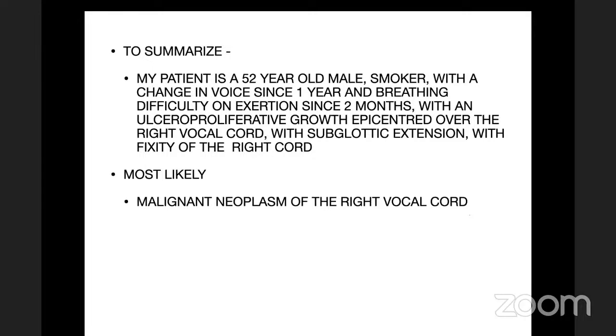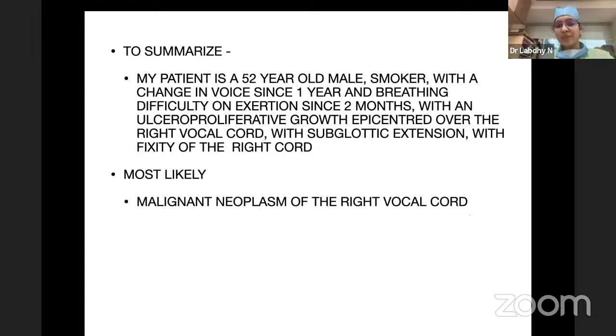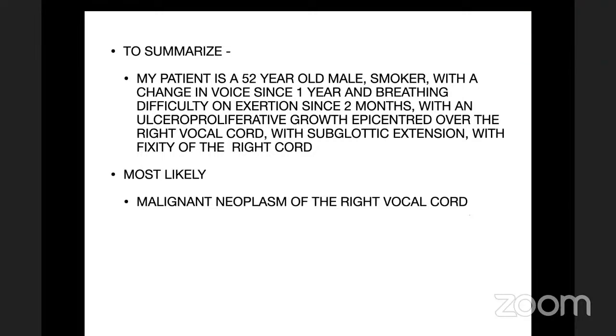Again, I want a little clarification. You want 1 millimeter cuts all the way from the top of the larynx to the mediastinum? You just said that you'll do a CT scan from top to mediastinum with 1 millimeter cuts. I don't know if Abhishek is there. Abhishek? Would you like to clarify, Lovely? Why do you do 1 millimeter cuts, and where do you do them? They give a better resolution when it comes to the larynx, the laryngeal framework.